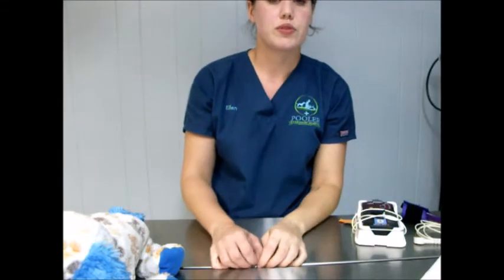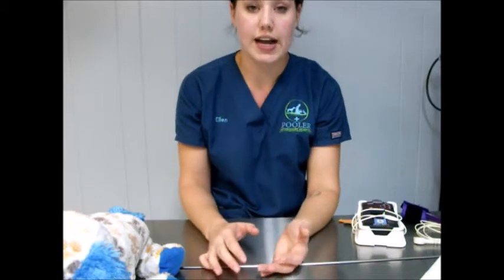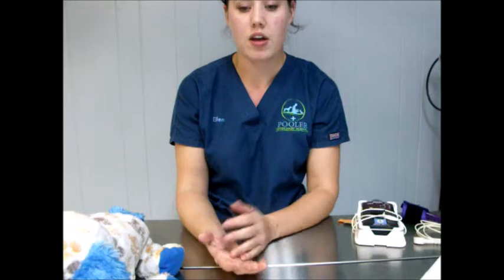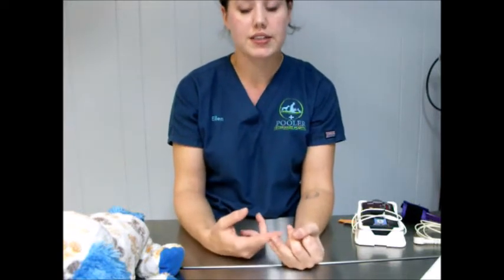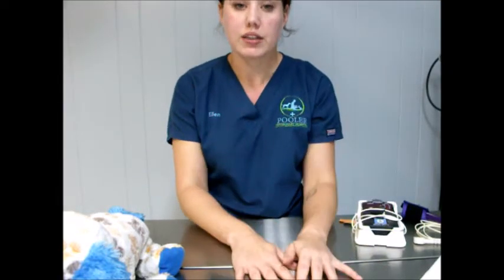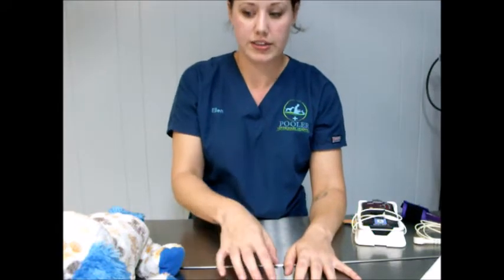Okay, so I'm doing task 6, which is monitoring with an anesthetic monitoring chart, or our discussion on physiological status related to patient reflexes to the depth of anesthesia. So, we want to make sure that when a patient's under anesthesia that they have the correct amount of immobility, muscle relaxation, pain relief, and central nervous system depression that we can properly do our procedure, but in doing so, we're also affecting that patient's physiological status with their cardiopulmonary system.